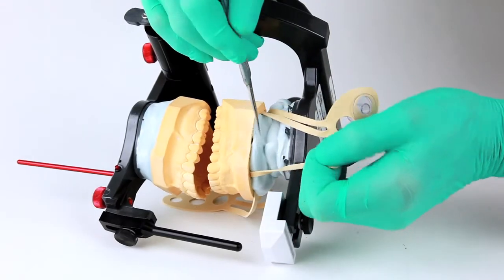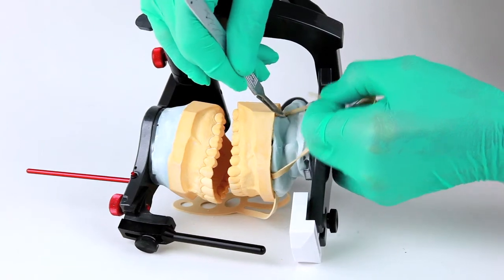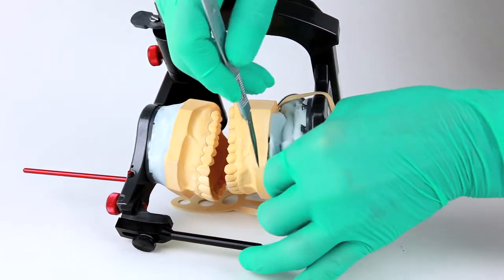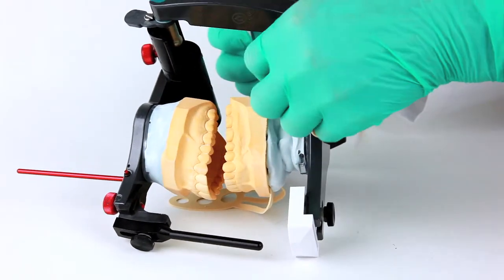The articulator can be repositioned for easy access to the flexi-mount attachment arms. With the individual arms stretched tightly, they can be easily cut at the base of the cast by using a sharp laboratory knife.